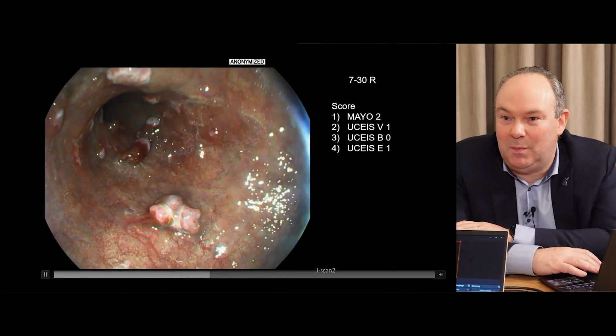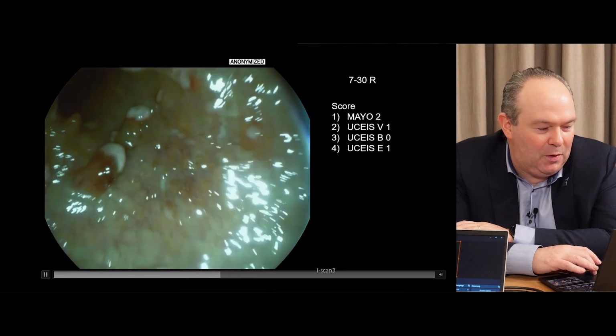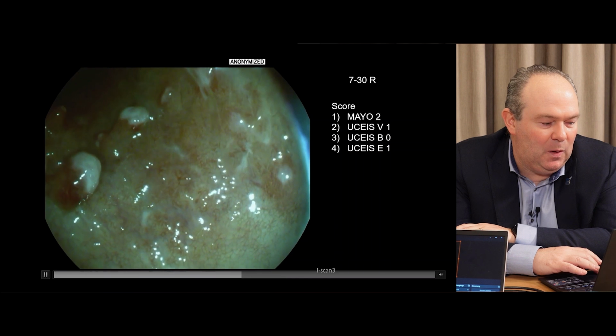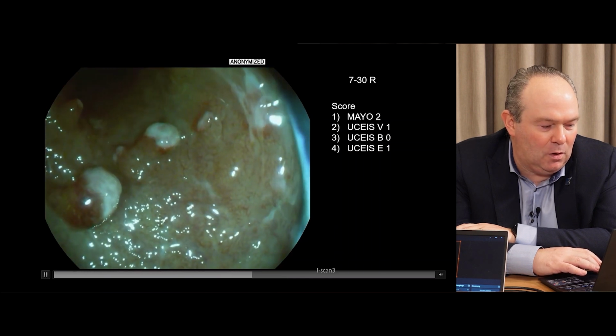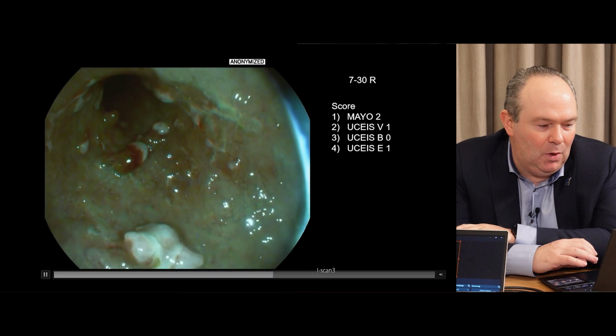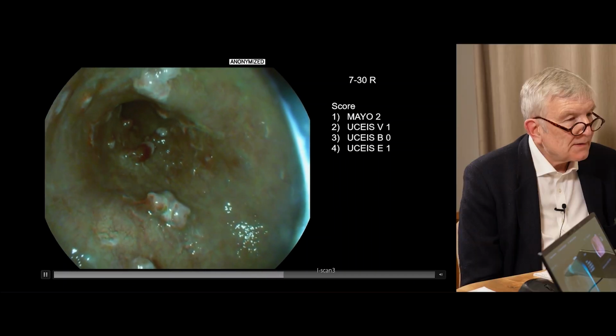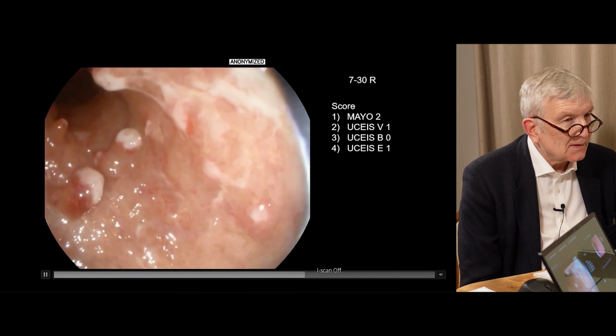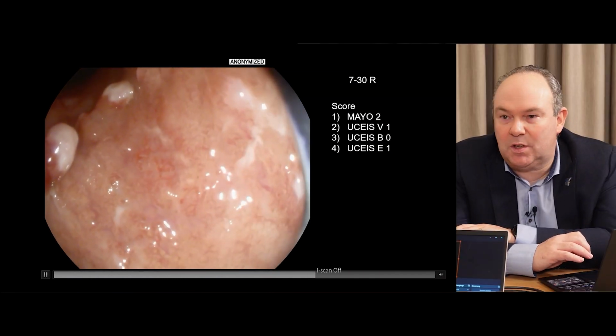So we just mention them as inflammatory pseudopolyps. Also, I think you should not get overexcited resecting them. It's a typical appearance here. They have a red, very inflamed stalk, and typically the fibrin cap on top. And that has nothing to do with surveillance, right? So these are almost never malignant. No, these are not, but it is a risk factor.